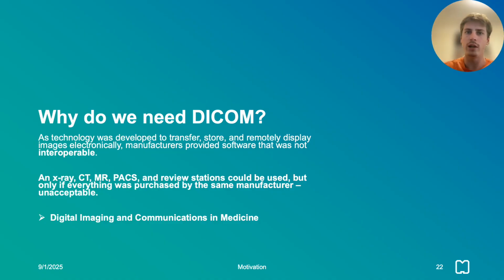So, why do we need DICOM? Well, a standard was needed as the alternative was neither scalable nor affordable. The need to develop open standards to promote interoperability between equipment from different manufacturers quickly became apparent. The first open standard effort for medical imaging was the ACR NEMA standard, published in 1985.